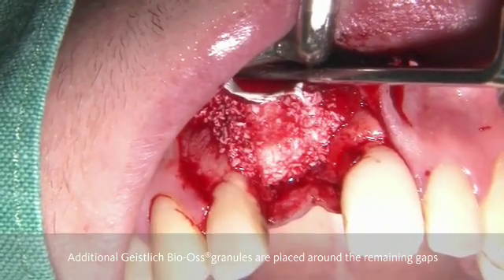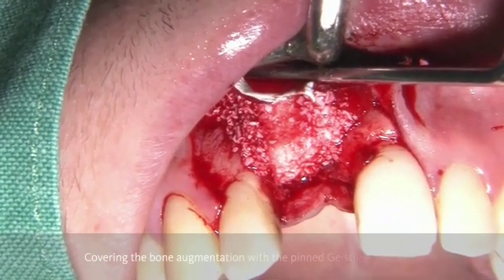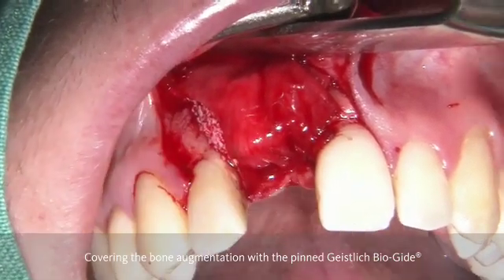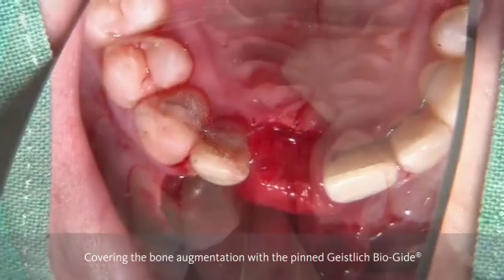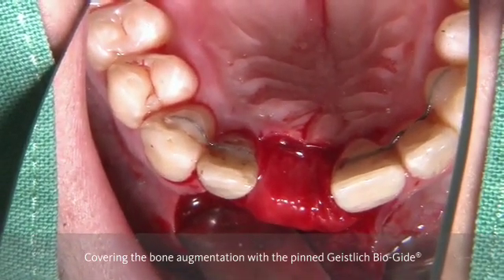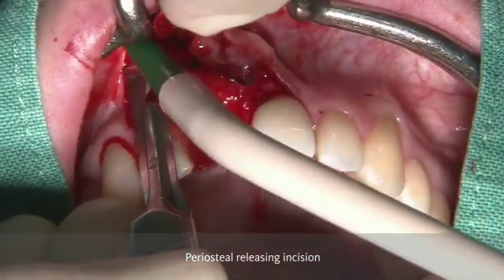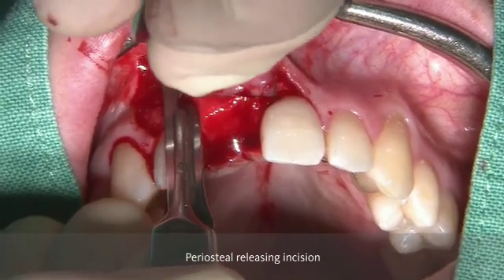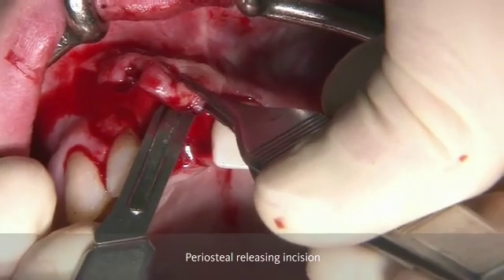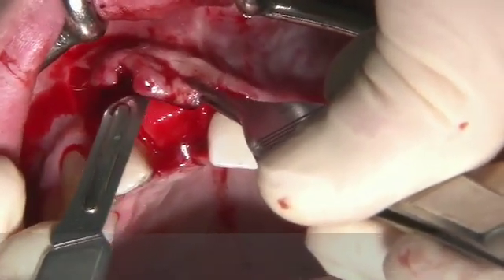With some granules around, you can smooth the margins. And as the membrane is tacked, you can now just put it underneath the palatal flap and you have a very stable augmented area. You can also nicely see the amount of stability we achieve with this technique. And we have more volume in the crestal part, where it is of utmost importance for the aesthetic area — in this transition zone between the soft tissue and the crown.